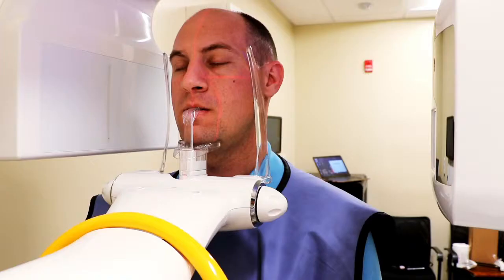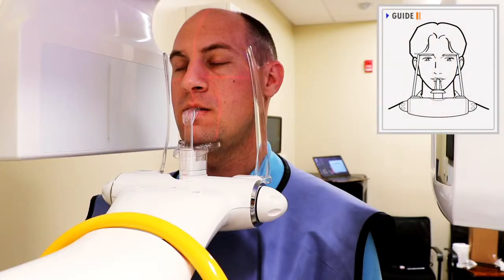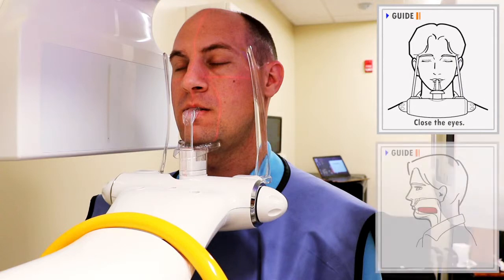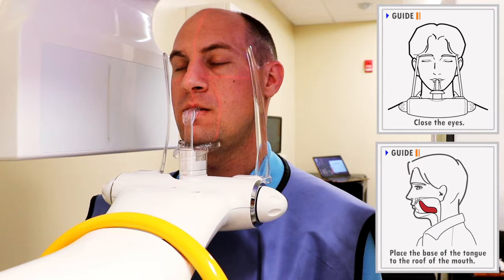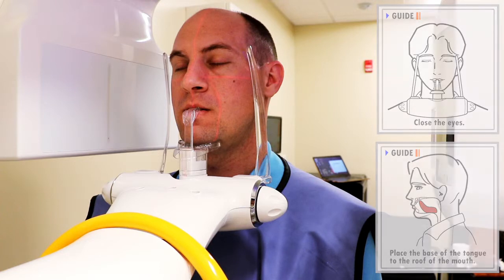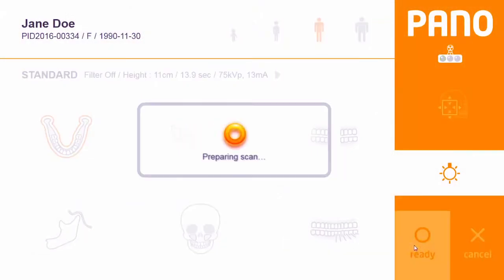When everything is ready, instruct the patient to close their eyes, and instruct the patient to place their tongue to the roof of their mouth. Press Ready on the remote control, touch screen, or scanner program.